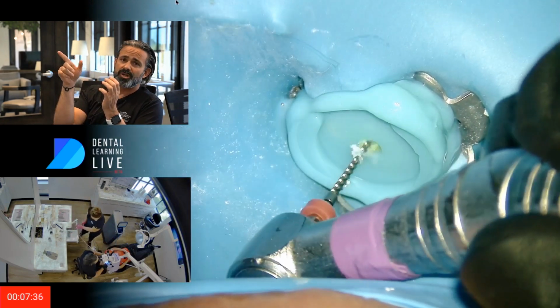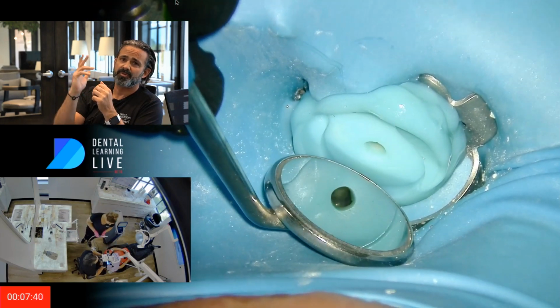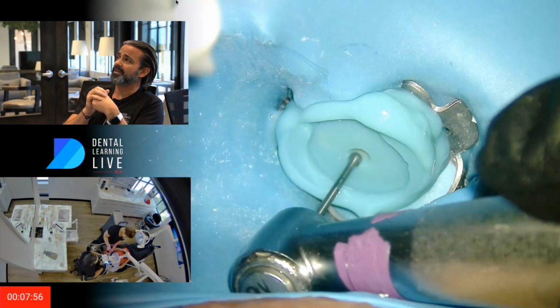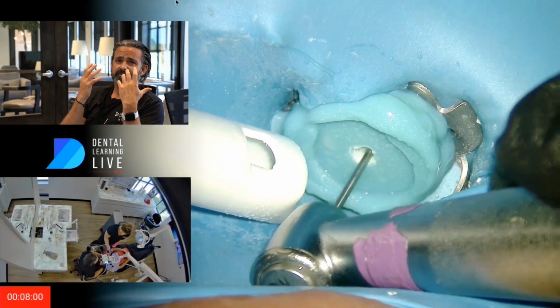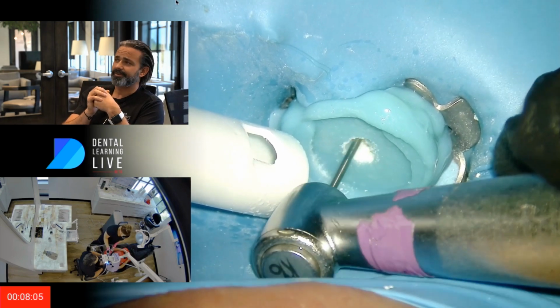I also put a sponge in it, and I always joke and call it the breadcrumb. I just pass a file in to pull the breadcrumb out. Breadcrumb meaning I know my way home, right? And now, because I'm thinking in terms of movement, I'm re-accessing this a little bit differently, and I'll explain why.